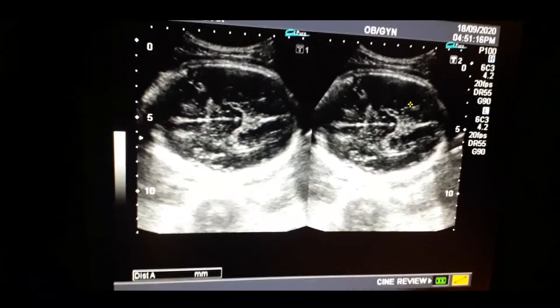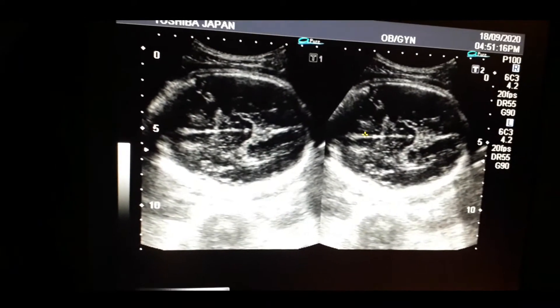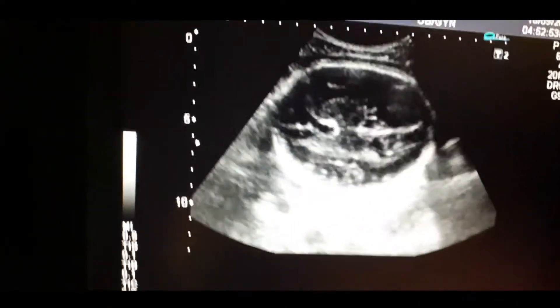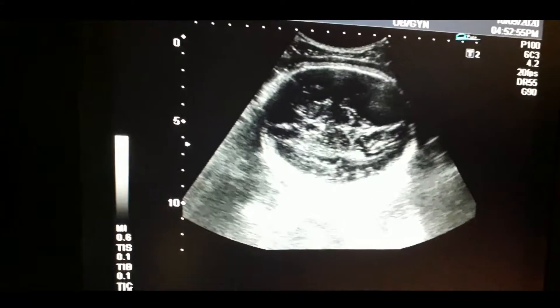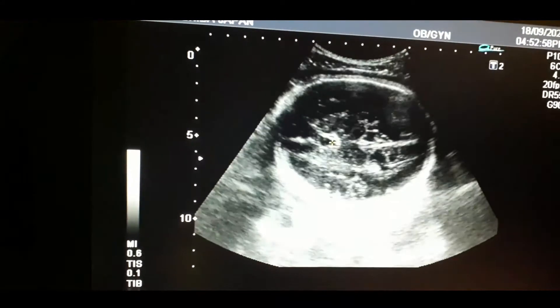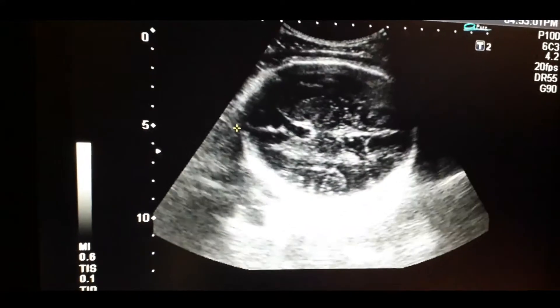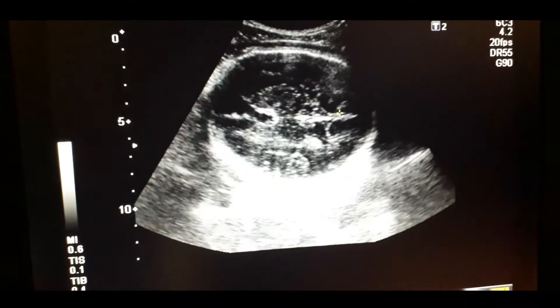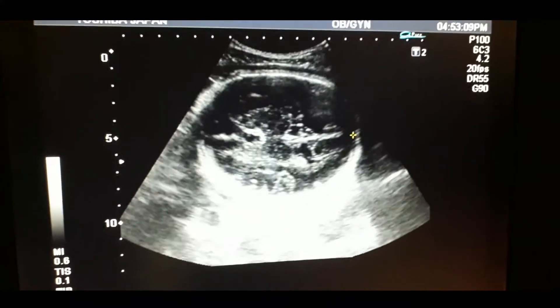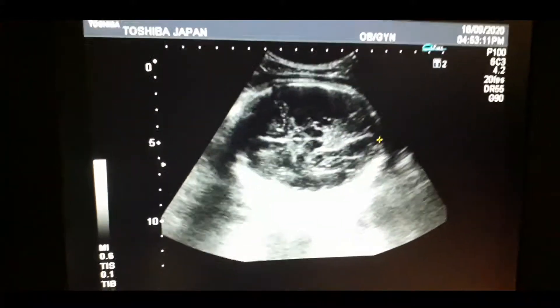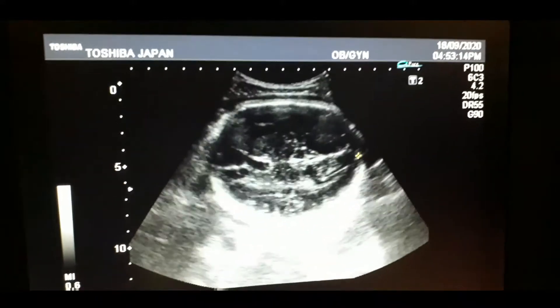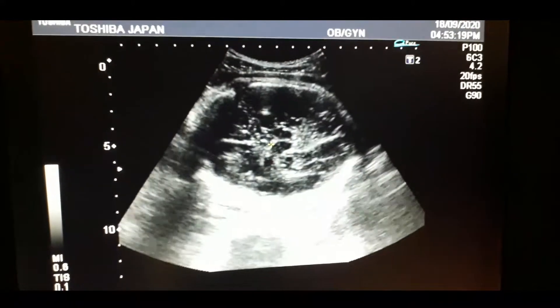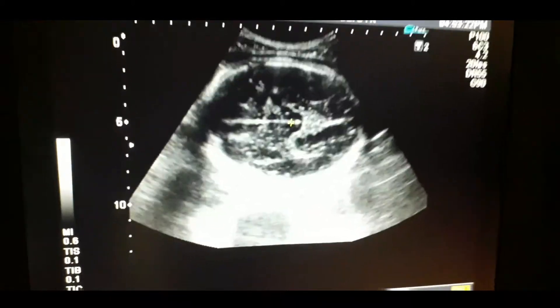So this is the transthalamic plane. Now we will locate the cavum septi pellucidi (CSP) that shows the forehead. This is the CSP — it is also a triangular rounded structure. You can see this CSP. The CSP shows the forehead and on the opposite side there is the occiput.